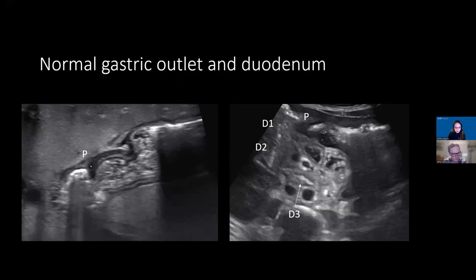In young children and neonates you should be able to see everything pretty clearly. This is the gastric outlet — the antrum, the pyloric channel. Most people overmeasure the pyloric channel using the antrum. In a normal child it should be very short. The muscularis layer is what you measure for thickening if suspecting hypertrophic pyloric stenosis. We also look for the proximal duodenum: D1, D2 near the pancreatic head, and D3 crossing — normally posterior to the SMA with an echogenic collar and anterior to the aorta.